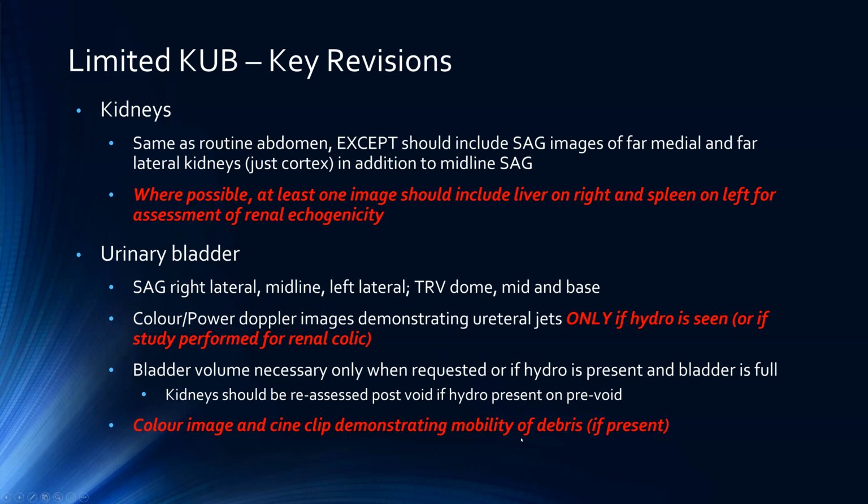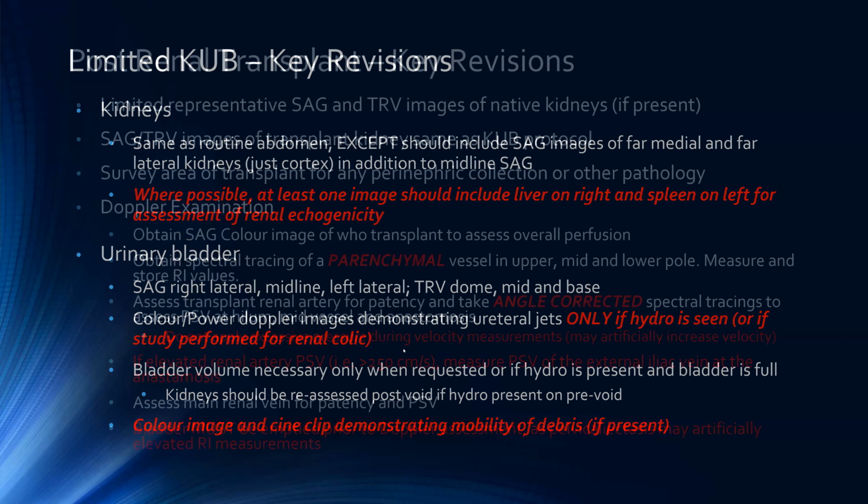If you do see any debris within the bladder, just take a cine clip demonstrating some mobility of that debris, either while repositioning the patient or just putting some variable pressure to show that the debris is present.